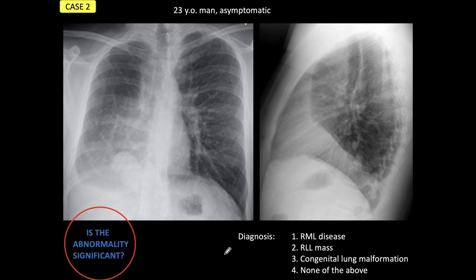We are back. Now let's analyze the findings. Apparently this patient is very sick because the right lung looks awful. But remember, the patient is asymptomatic. So let's try to find a reasonable explanation for the findings. The first thing that calls our attention is this possible mass — we don't know what it is, but it is very worrisome.